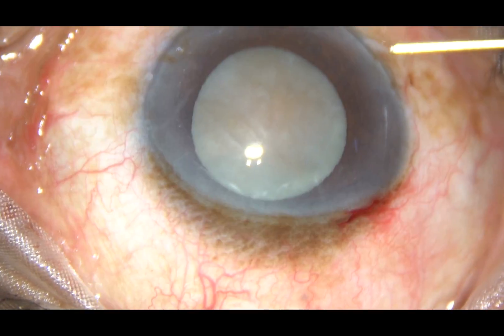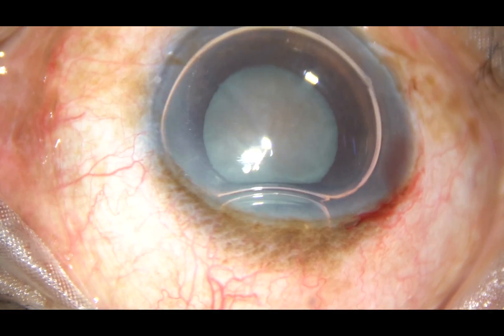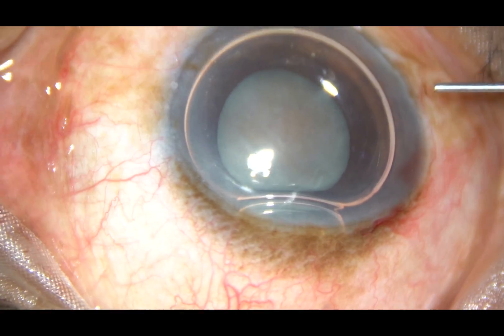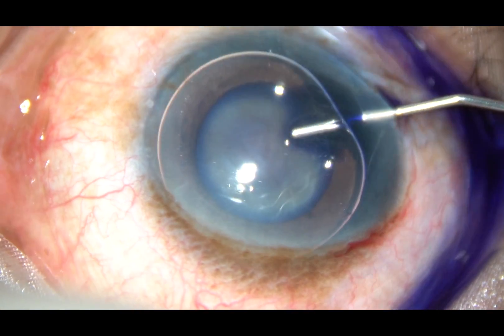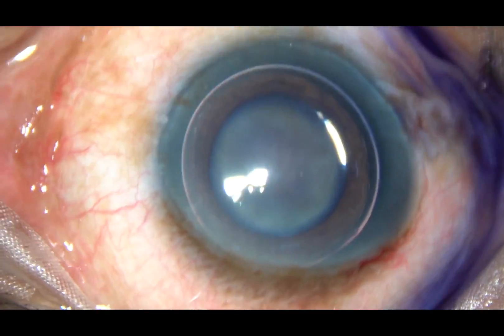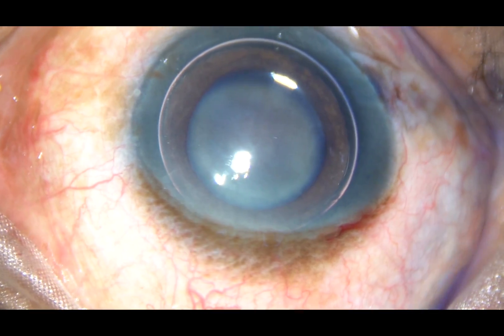By this time, all the incisions have been made. Now, this is an air bubble. I want to stain the anterior capsule with trypan blue dye underneath this air bubble. This is the dye. The dye is applied on all parts of the anterior capsule.